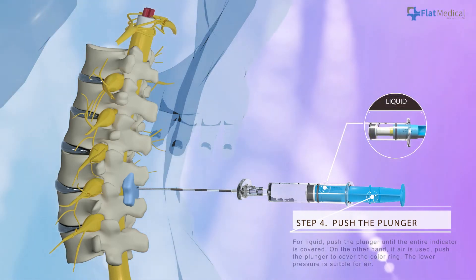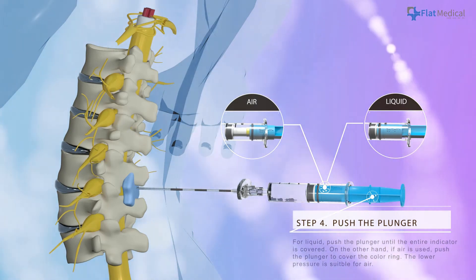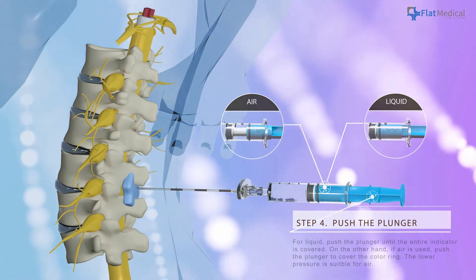push the plunger until the entire indicator is covered. On the other hand, if air is used, push the plunger to cover the collar ring. The lower pressure is suitable for air.